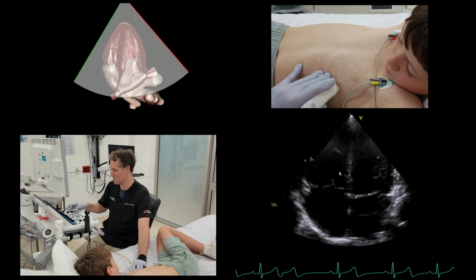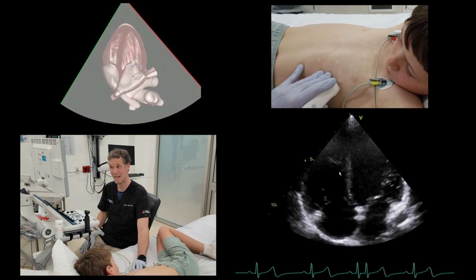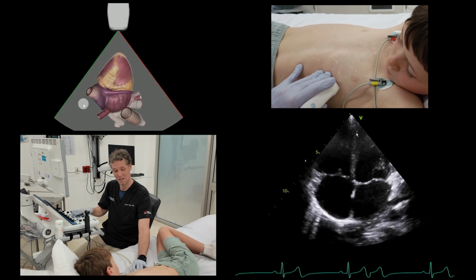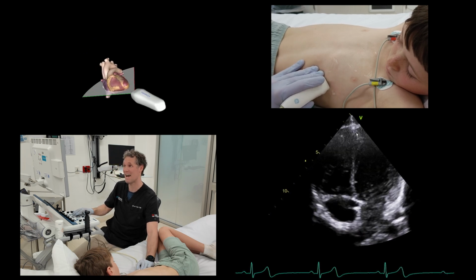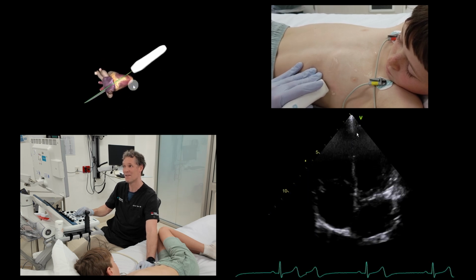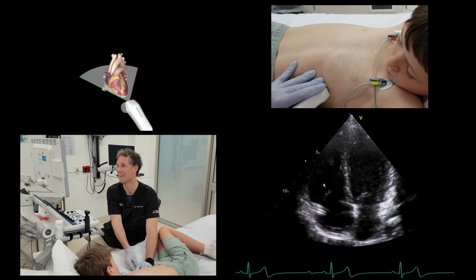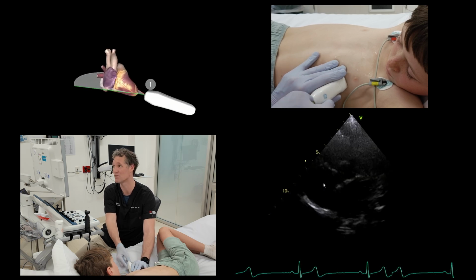Now, one of the things that we might be able to see with this is that the right ventricle actually looks a lot bigger than it did in some of the other views. And that whole heart looks almost spherical in shape, like a soccer ball. So that might tell us we're actually a rib space too high. And so what I might try and do is even come down a rib space and angle up. And here you can start to see it. The true apex is maybe a little harder to view, but it looks much more like a rugby ball. And you can see it almost looks a bit longer than it did before. And that right ventricle doesn't look as big as it does when I'm a rib space or two higher.